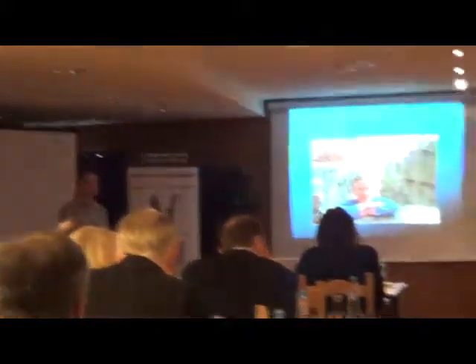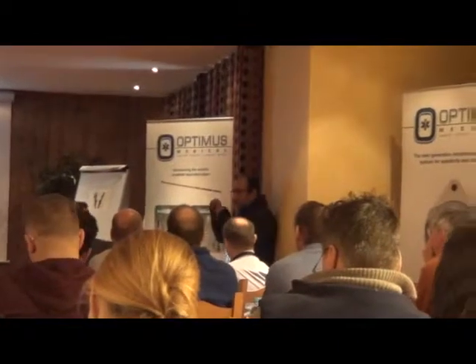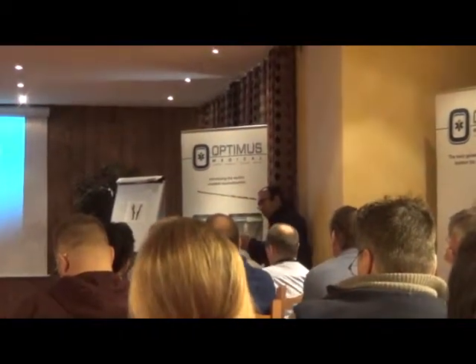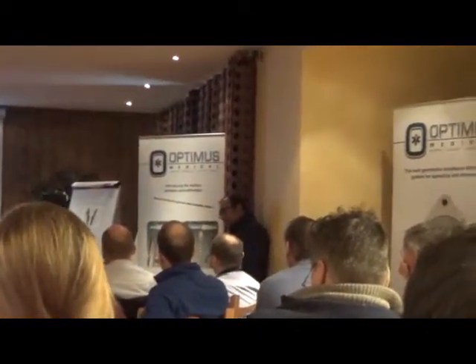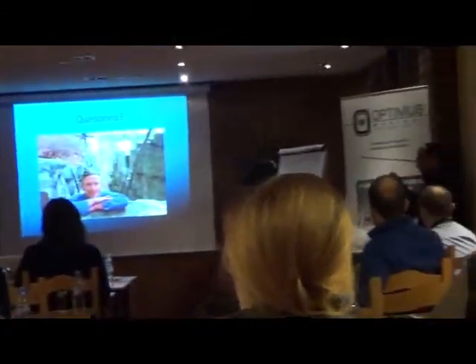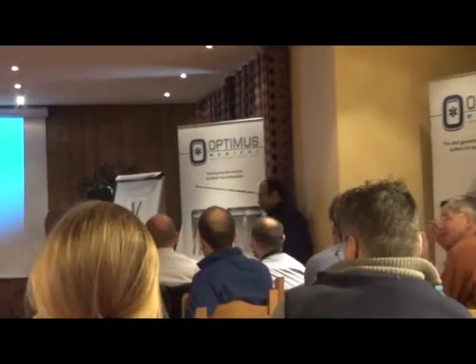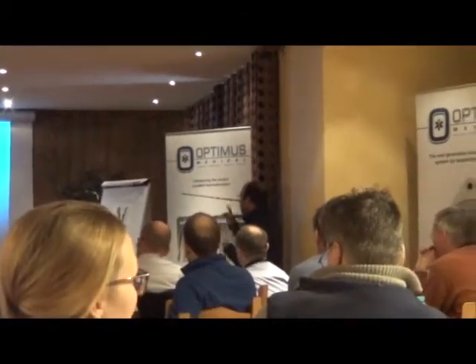There is a new piece of kit. One of my colleagues from the Far East was telling me it comes with a little balloon at the end of your epidural needle. Have you used it? We have tried it, but we stopped it after several cases. I only heard about it, very critically reviewed. Basically, when you put it in the epidural space, the balloon just collapses, and you use it in the lower region. Right.